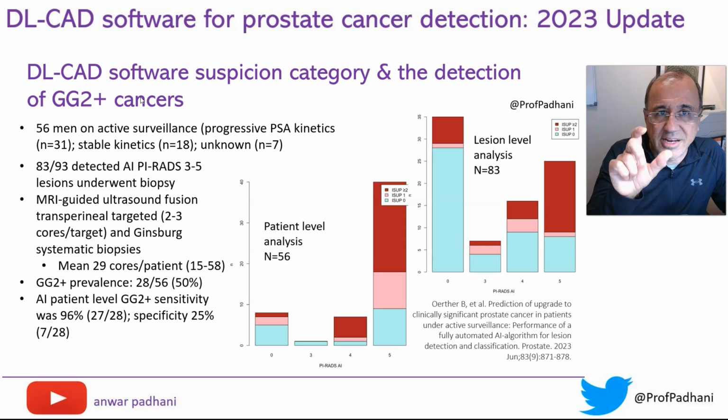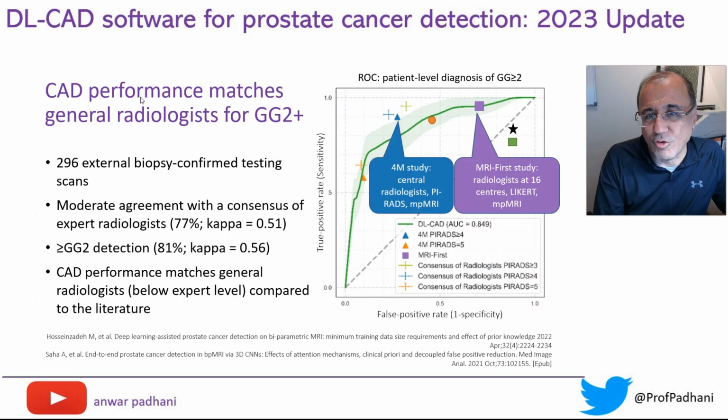So showing that in fact these calls that it's making is in fact translating to the improved detection of clinically significant cancers.